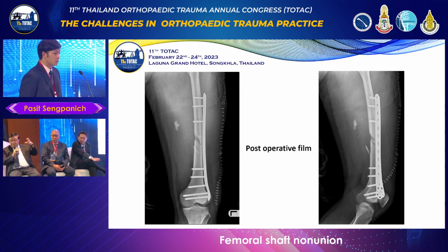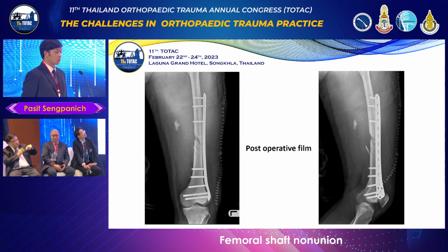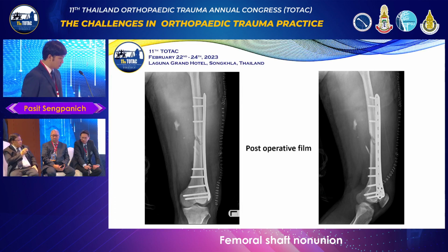Maybe in retrospect, when you look at the X-ray, probably you should put more screws, closest to the fracture. Because if you try to find the reason why this plate failed, for sure it is either not long enough, or the number of screws is not enough to hold the fracture. In this case, I think the length of the plate should be okay, but maybe the number of screws is not enough, the spanning is too high.